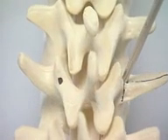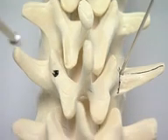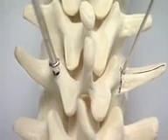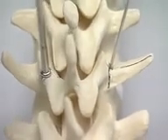The pedicle probe is removed, and a K-wire is inserted. Note the significant medial angulation with the use of the lateral intersection method entry point. Use the pedicle awl to open the posterior cortex through the more medial entry point. In vivo, a rongeur may be required to remove the base of the articular process.